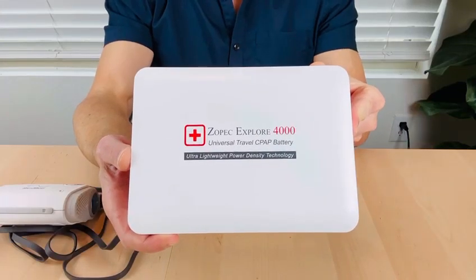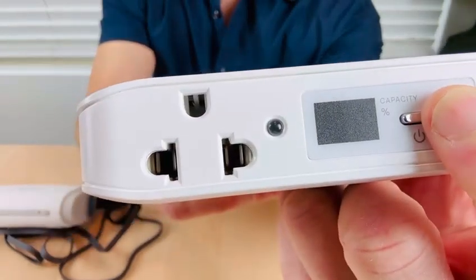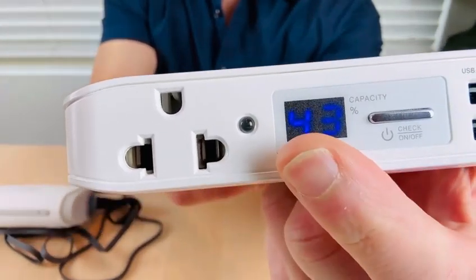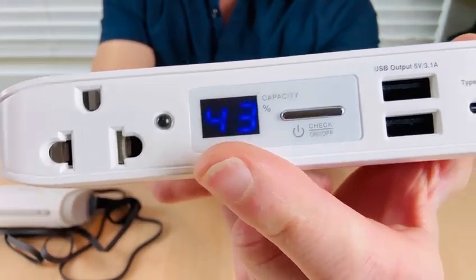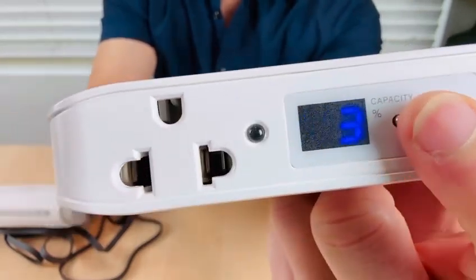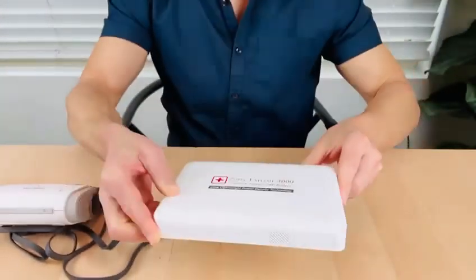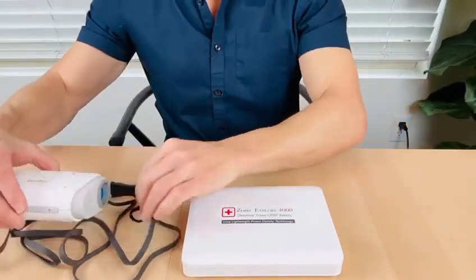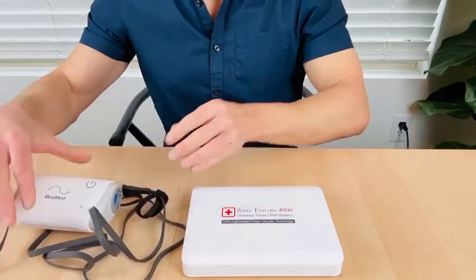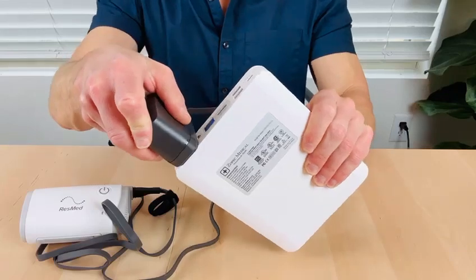I will now show you how to connect a ResMed Air Mini to the Explorer 4000. Step one: click and hold the power button until the digital screen is turned on. This will turn on your battery and activate the USB ports. Click a second time to turn on the power outlet. You will notice a red light indicating it is now ready to supply power. Step two: simply plug in your Air Mini using the ResMed power adapter to the AC outlet.